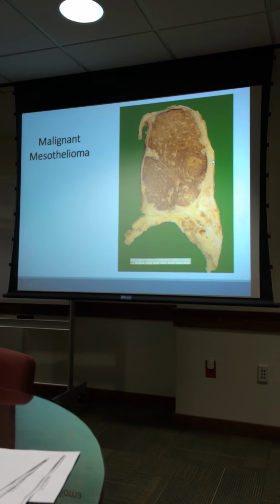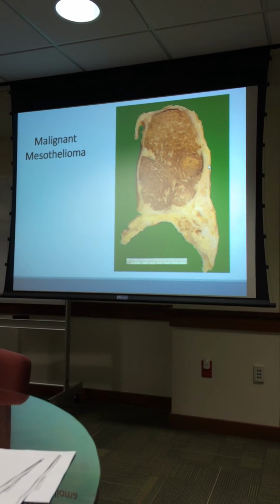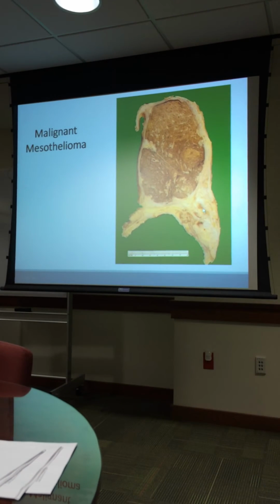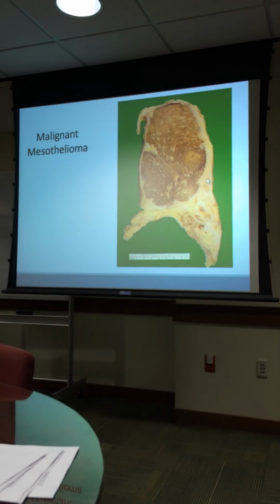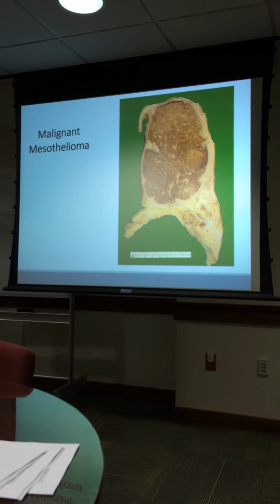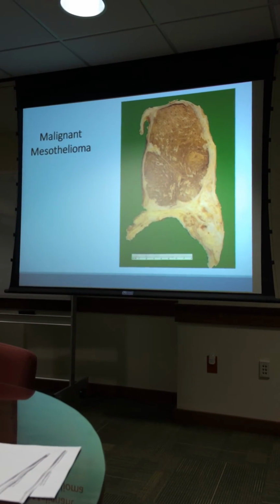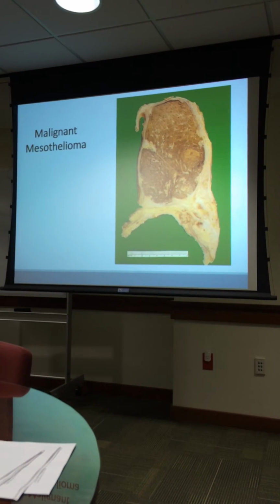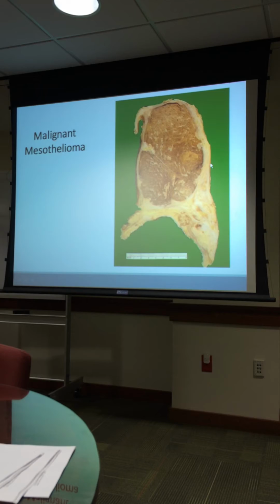They'll put it together, and then there are other things that we can do in cytology in terms of special stains to identify the cells as mesothelial cells. I think our role in hematology is just to say, oh, look, there are a lot of mesos. It's a cellular specimen. Some of the cells look funny, and just send it on to cytology, and we can do more studies.